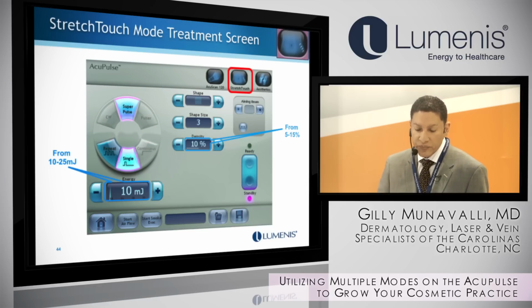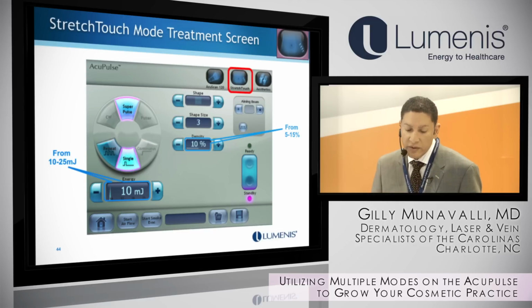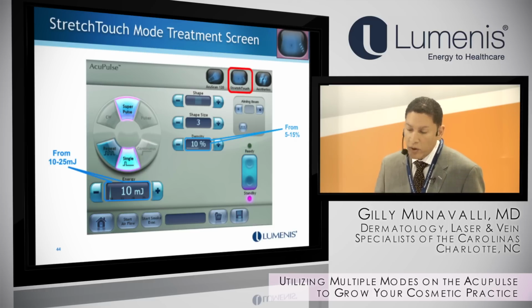It's another study. In terms of the settings that we use, you can see we don't use very high density with these. We use actually very low density, 5-10%, and I actually go higher on the joules now. So I'm going up to probably 15, 20 millijoules. So you're not getting a lot of contraction at the skin, but you're getting a lot of penetration into the 1.2 millimeter range, and so you're getting a nice column of heat in there.